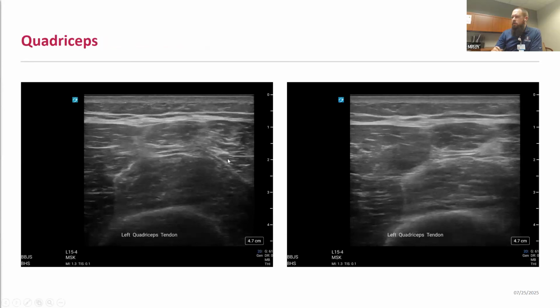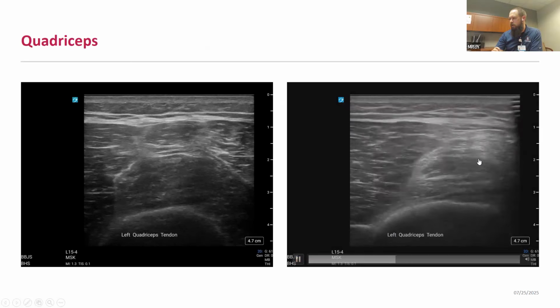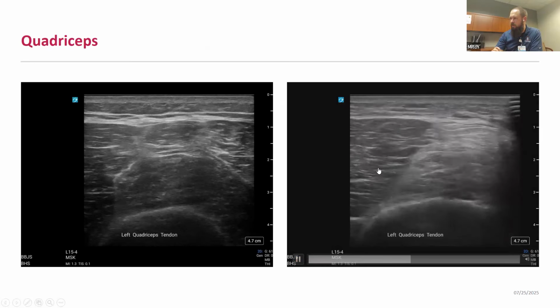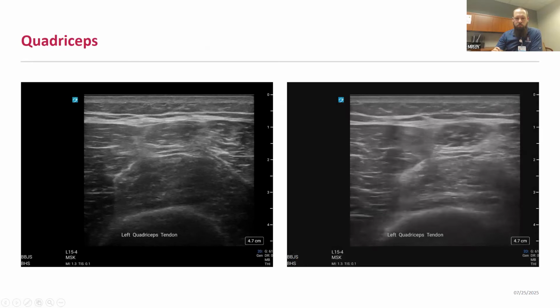Looking specifically at the quadricep tendon, your quadricep is going to be made up of 4 different muscles. On the short axis view here, more proximal within the thigh, we've got your rectus femoris, your vastus medialis, lateralis, and intermedius. And as you track that more distally, you'll see those come together as the quadricep tendon, with the vastus medialis muscle being the one that extends furthest distal compared to the other surrounding muscles.